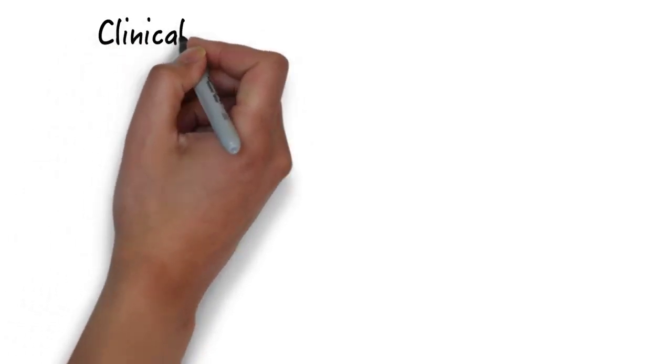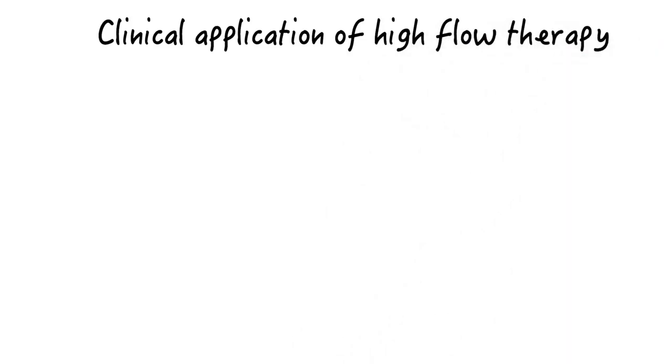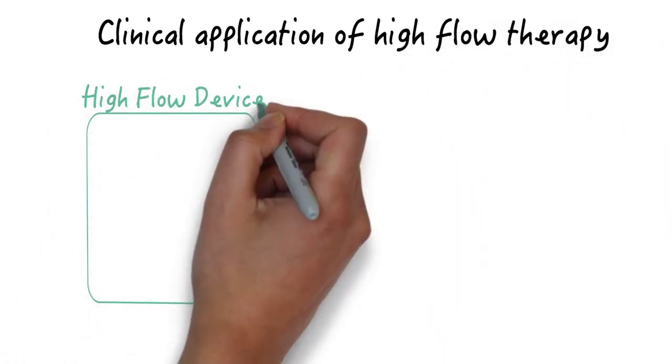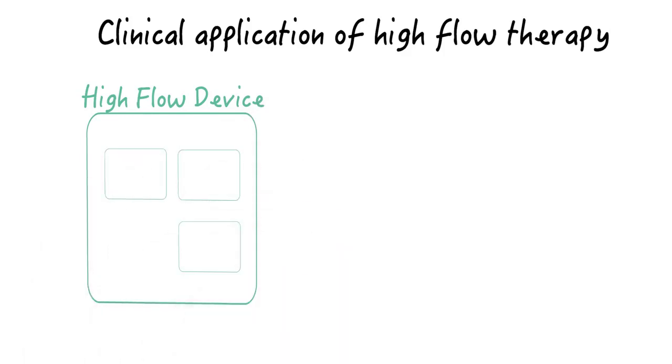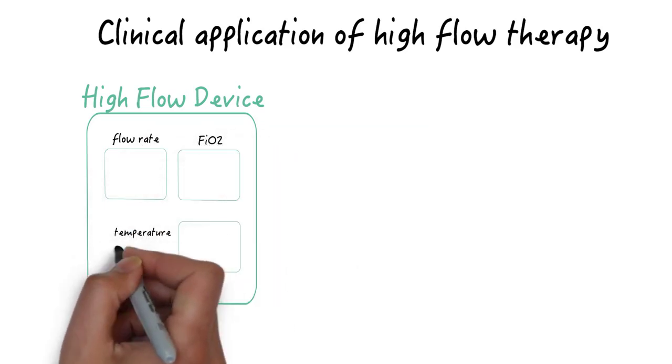In the previous video, we talked a little bit about what high flow therapy is. In this video, we'll quickly highlight the clinical application of high flow oxygen therapy. We already discussed that high flow therapy is not a replacement for non-invasive ventilation because it is not capable of providing the same level of ventilatory support like NIV.